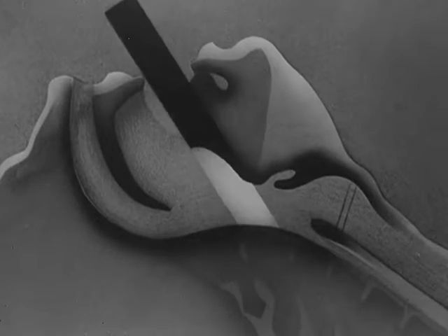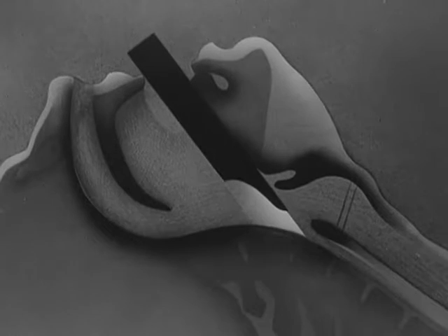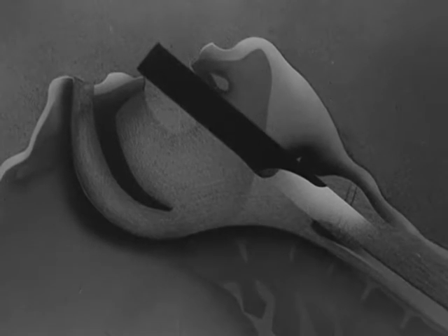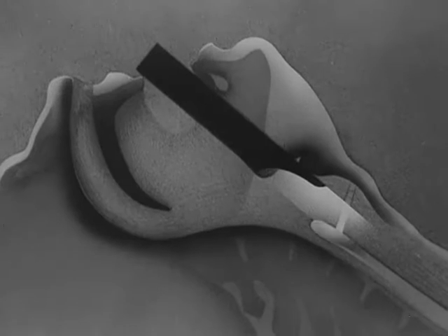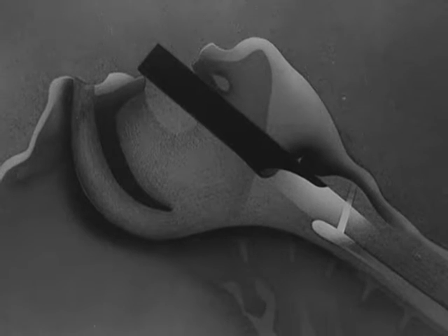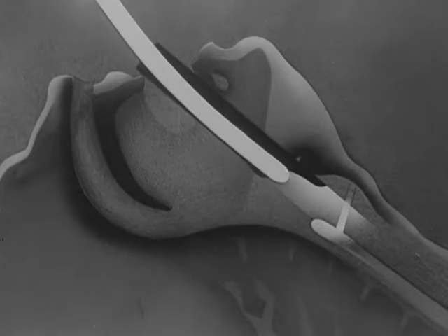When it is reached 2/3 of the full distance, the epiglottis is seen. When this appears, the laryngoscope should be gently advanced and the epiglottis lifted and held by the tip of the instrument. Finally, the glottis and vocal cords come into view. So long as the glottis is open, the tube can be passed along the lumen of the laryngoscope into the larynx.